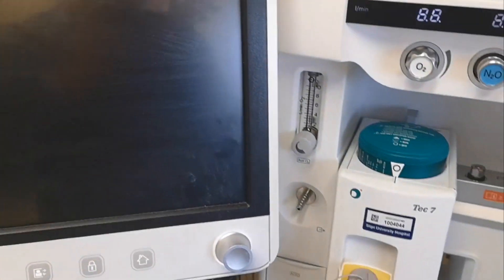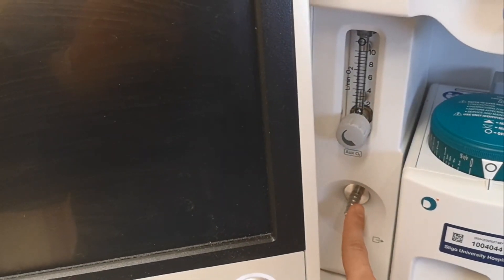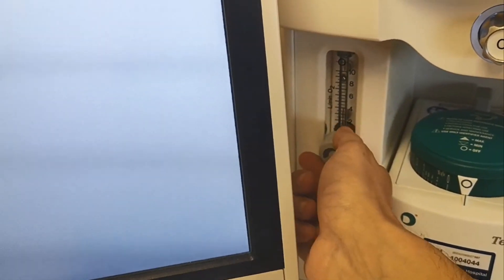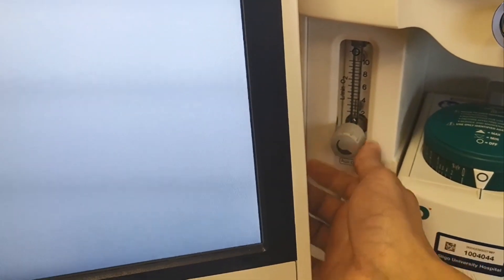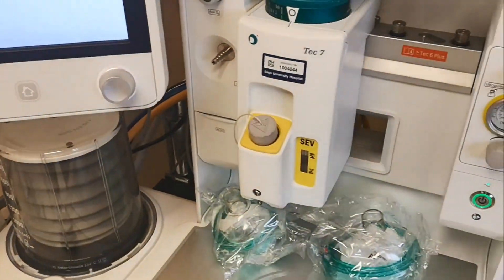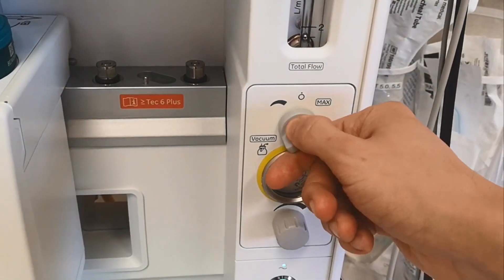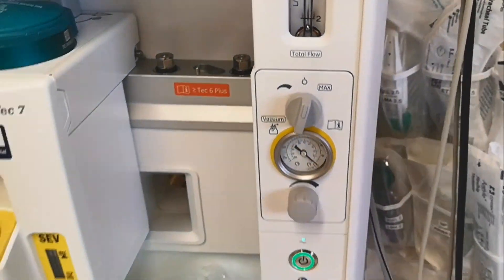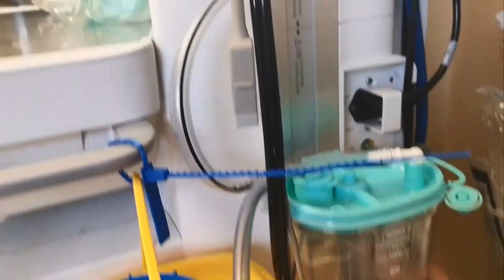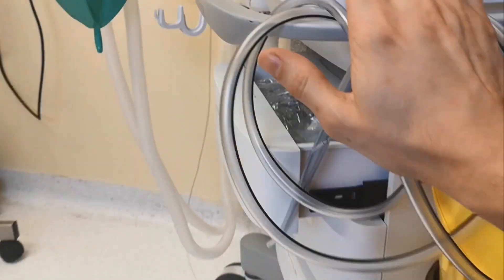While you're waiting, you have the other oxygen supply here, same as before — independent from the circuit, open and close. You can attach the mask here or the nasal prongs. Your suction unit is there, and your suction vacuum chamber is here, similar principle, coming from the back of the ventilator — that's your line.